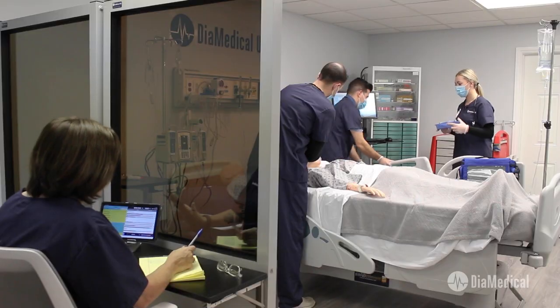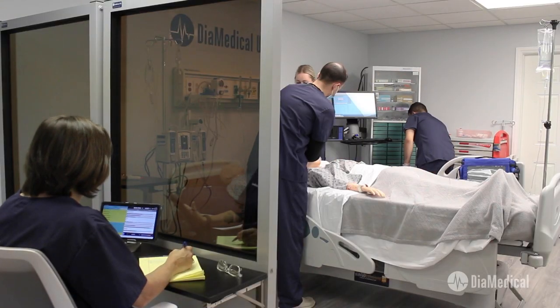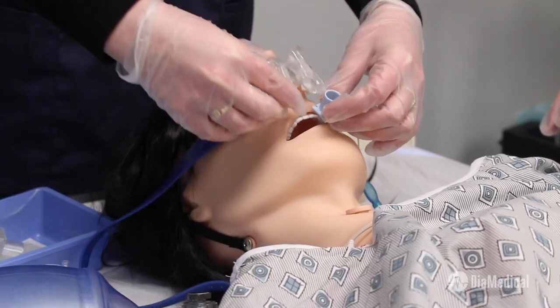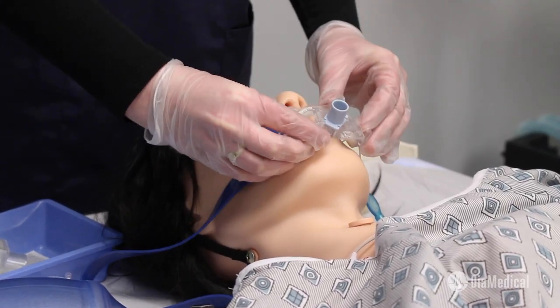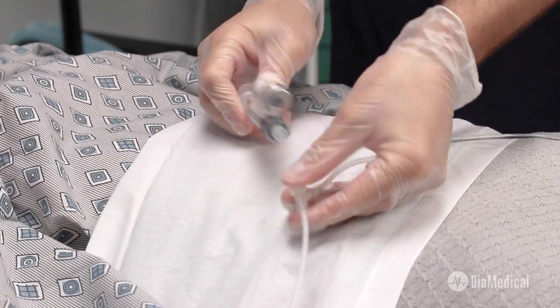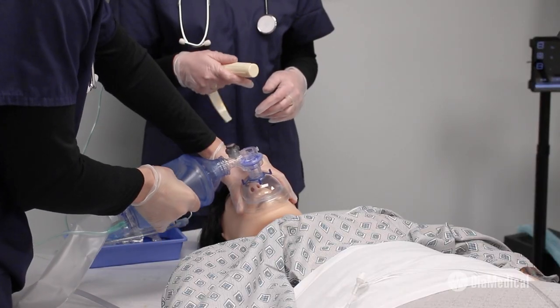Pediatric resuscitation is one of the scariest situations for healthcare professionals. Chest compressions and airway management interventions must be specific to the child's size, and dosage calculations carry a far higher risk for medication errors. Fortunately, pediatric mock codes are a great way to improve competence and teamwork in a safe, controlled environment.